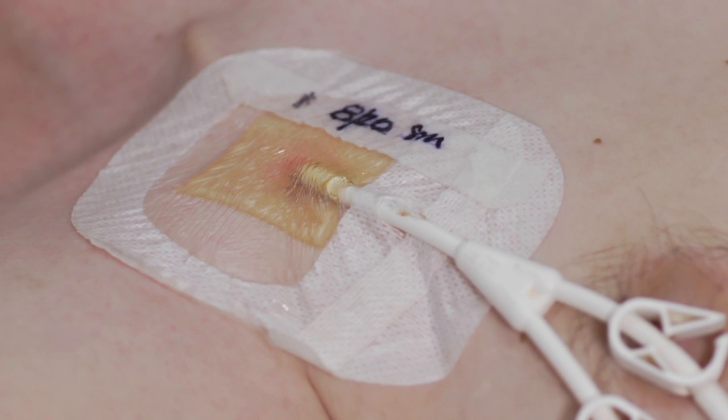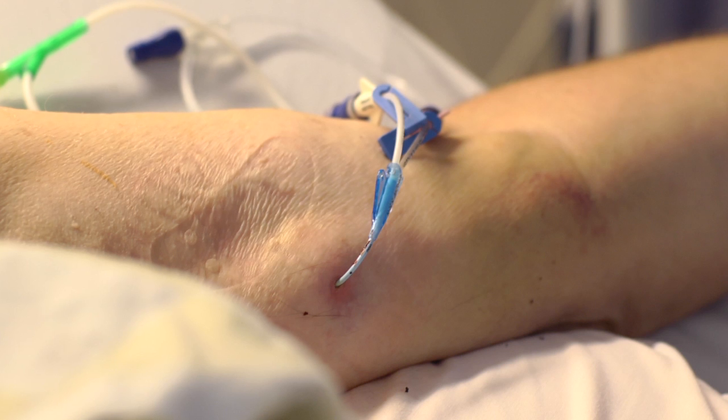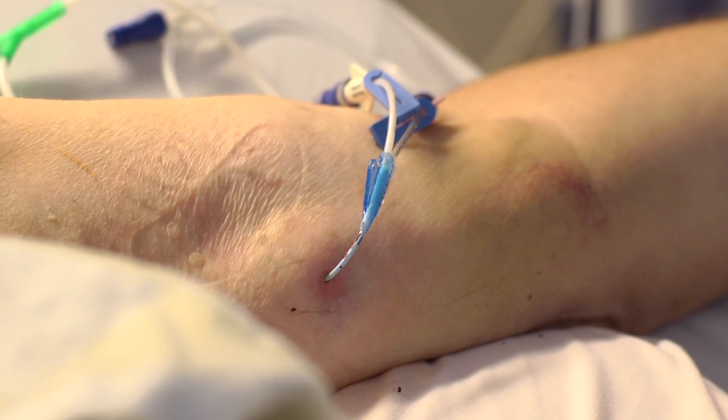Before you do anything with the line, your nurse needs to make sure that it's safe to use. They will ask the patient if there has been any pain or problems with the line, or any bleeding or discharge from the site. The nurse will look at the site of the line to see if there's any redness or drainage at the insertion site, which could be a sign of infection or signs that something is wrong with the line.